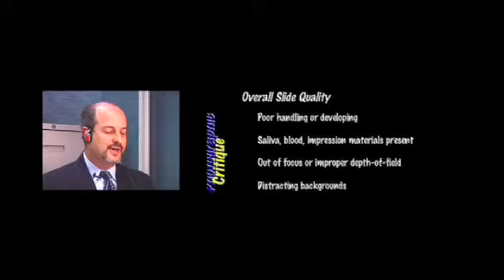But anyways, you be careful how you handle them and how you develop it. Certainly you don't want to have blood, saliva, impression material in the teeth, especially if you're planning on showing these to patients like before and afters. They don't like impression material, these types of things. We're used to looking at that stuff between teeth, but they're not. Certainly appropriate focus, appropriate exposure, the appropriate depth of field, really crucial.